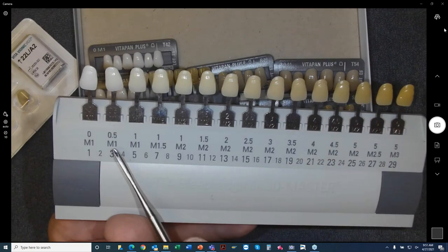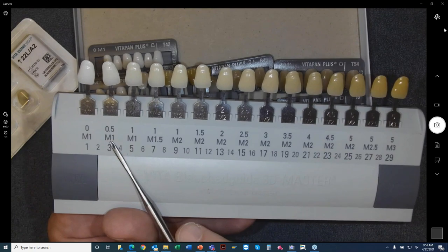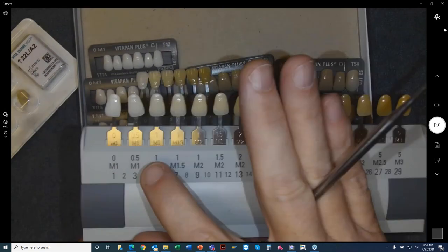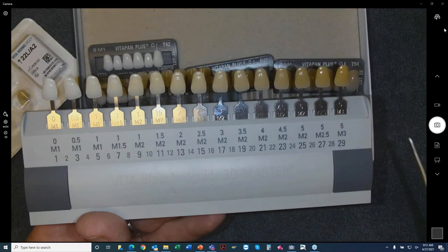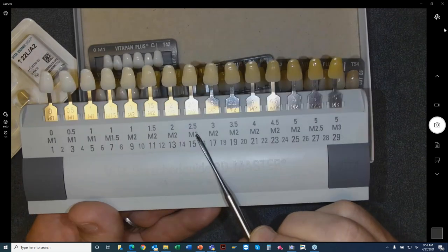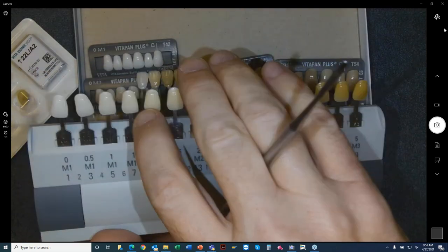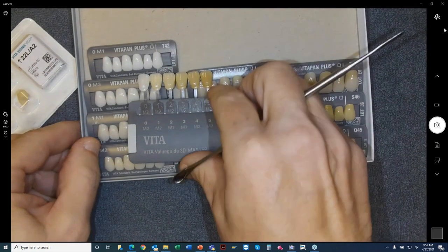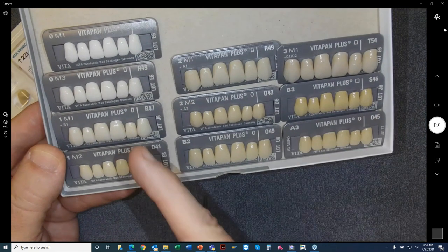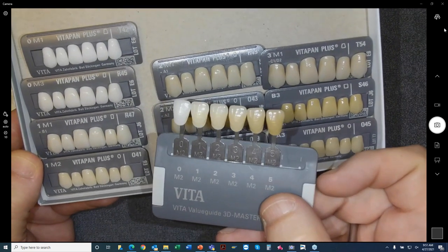talking about, oh, well, I took a shade for my denture tooth and it's a 0.5 M1. Well, we don't make denture teeth like that. This device actually is for bleaching. So if you get a shade in on a prescription that's an in-between shade, for instance, like 2.5 M2, they're using this bleach guide. And again, that's another reason why you should have them control their shade taking using the actual cards of teeth in a light, medium, and dark, or use something like this that's already controllable from light to dark.